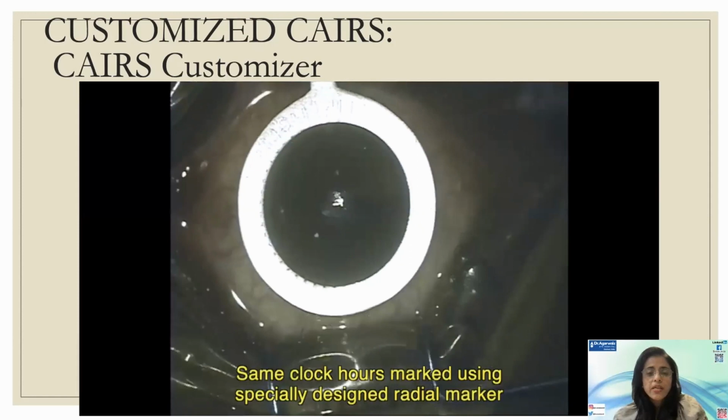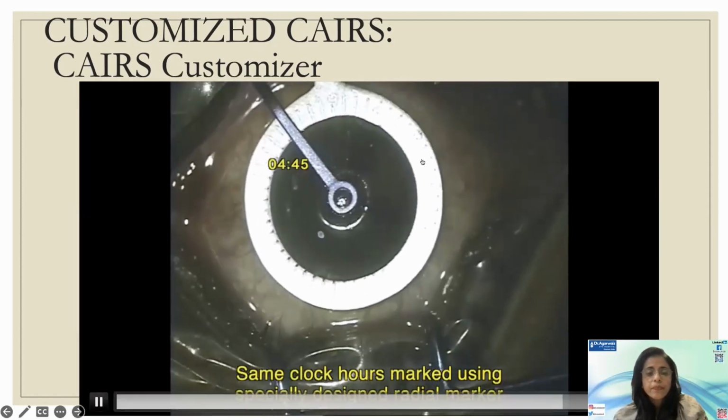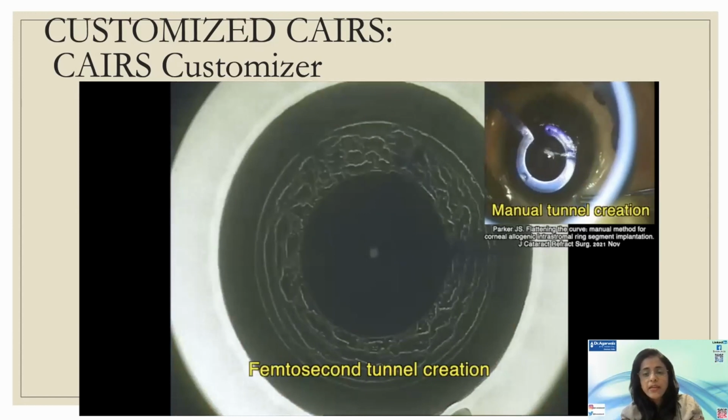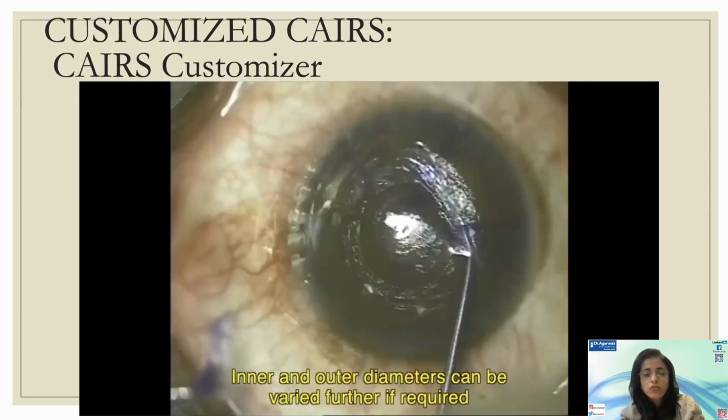And this is the patient's eye. Again, instruments that I've designed, the degree zone marker, as well as the single radial marker, which allows you to put those marks exactly on the patient's eye. You can also, of course, put the patient on the slit lamp and mark the horizontal axis before starting all of this.